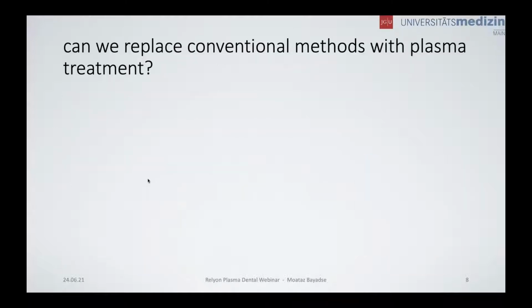We already know that plasma pretreatment increases the wettability of titanium and zirconia, but other dental materials have not been investigated yet. The influence of cold atmospheric plasma with ambient air as operating gas is also not sufficiently investigated. Therefore, we decided to do our own study and answer a couple of these questions.